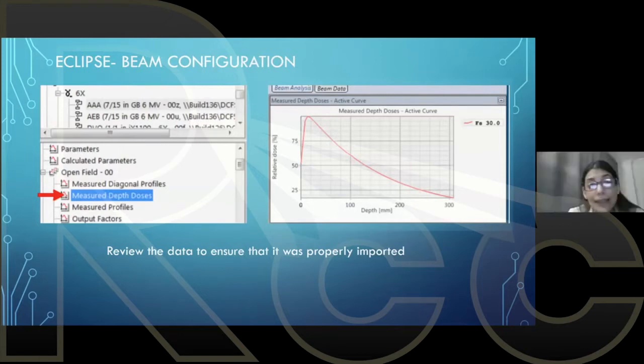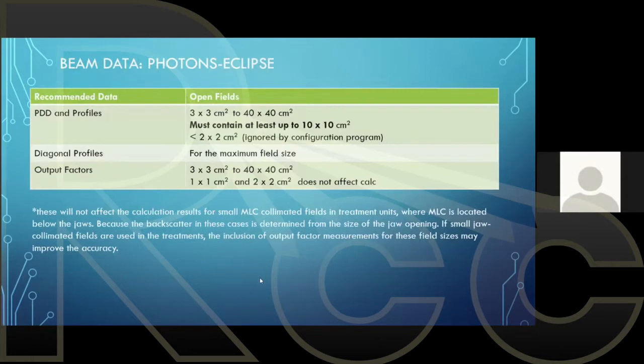From your previous slides regarding the ECLIPSE, because I have experience with the ECLIPSE, is it interpolating? I know for the lower values, less than 3x3. Is this interpolation just a linear interpolation, or what kind of interpolation does it do? I think it's linear, but you know what? Since I haven't done this in some years now, let me get back to the manual, and then I'm going to email you my response.